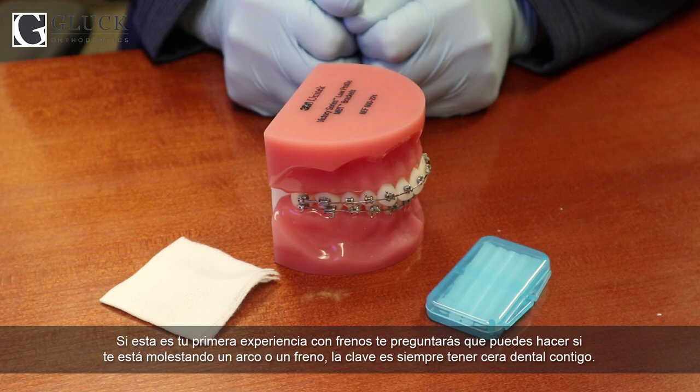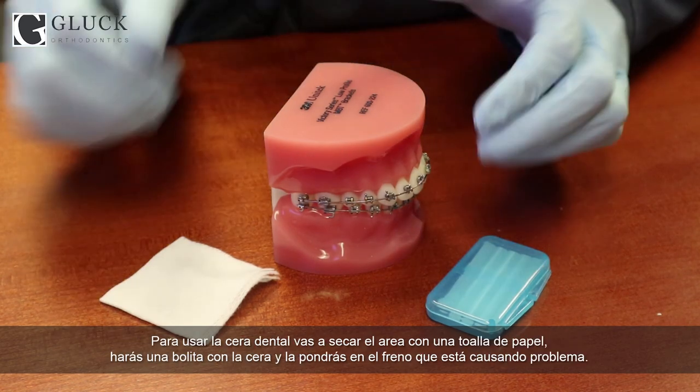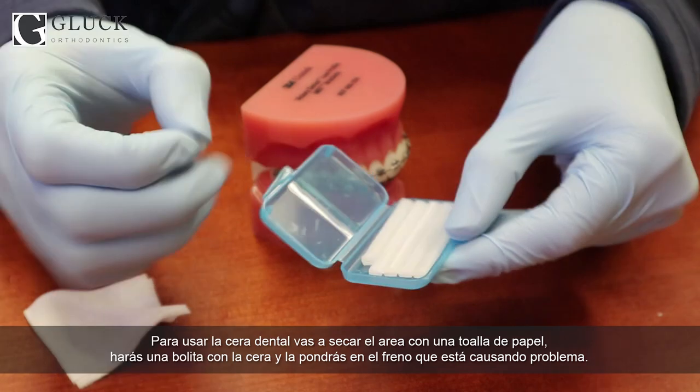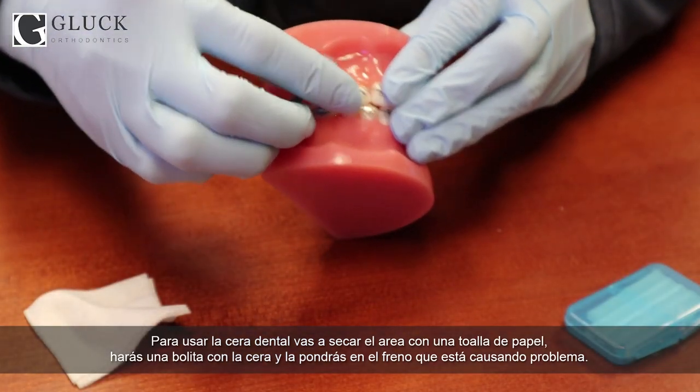If this is your first experience with braces, you're probably wondering what to do if there's a wire or a brace poking. The key to this is keeping some wax around. We have a bunch here at the office, and we'll make sure that you leave with plenty. To use it, you'll want to dry the area off with a paper towel. Then take your wax, roll it into a ball, and push it onto the braces.